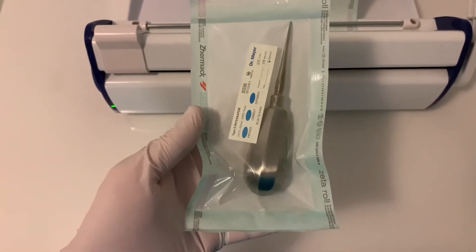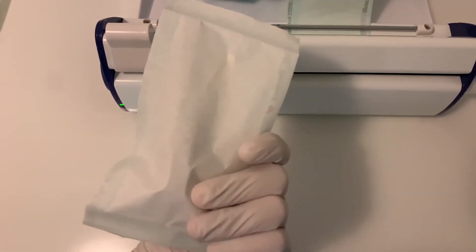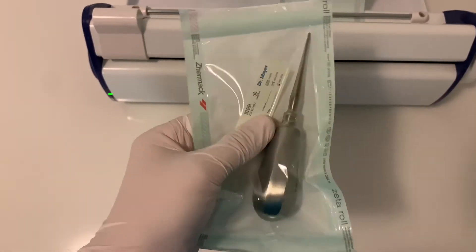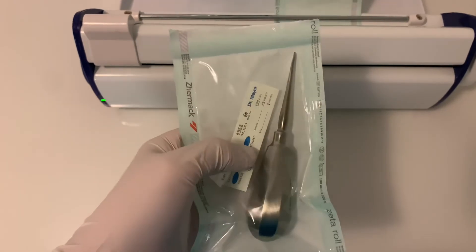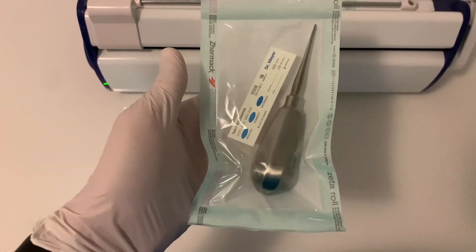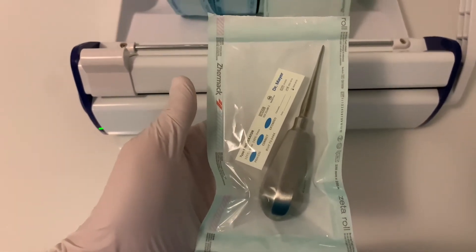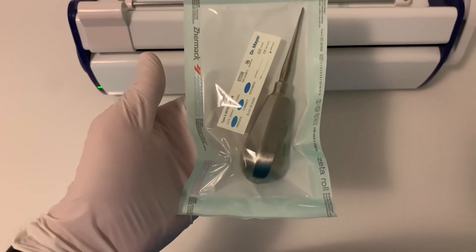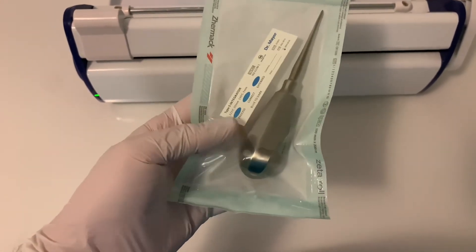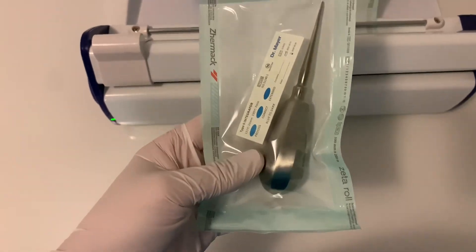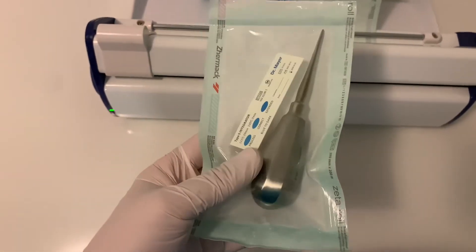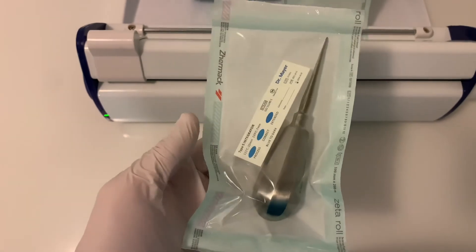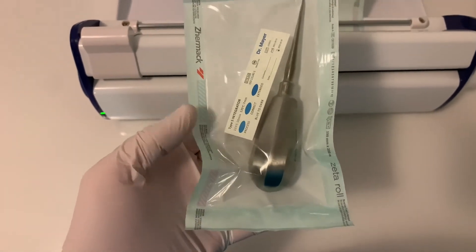This is how it looks with an instrument sealed inside. I've included a Class 5 integrated integrator strip, therefore assuring the sterilization process inside the bag is within parameters.